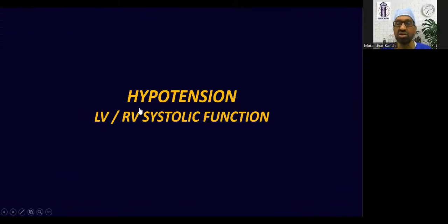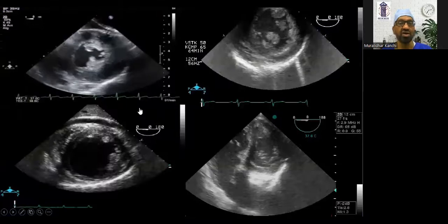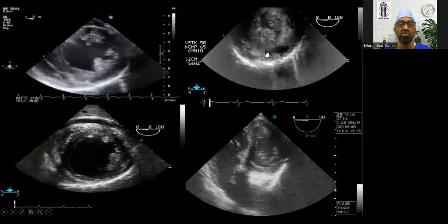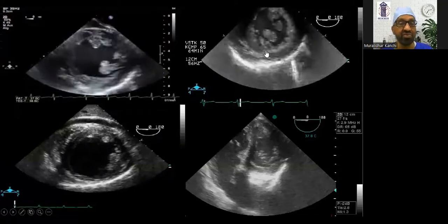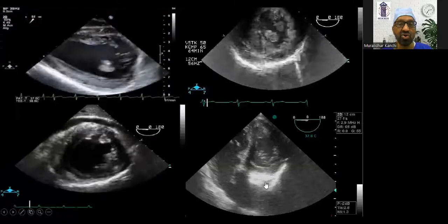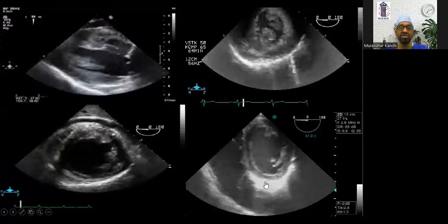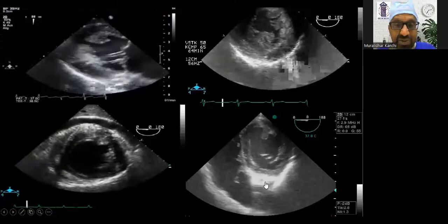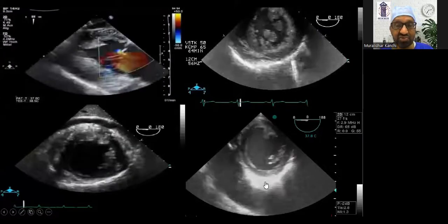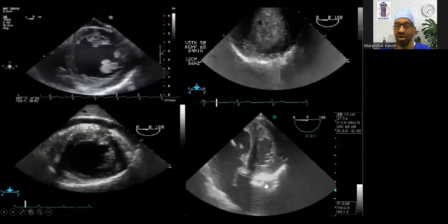Is it cardiogenic shock, or is the cardiac function normal and the patient hypovolemic, as shown in the right upper quadrant of the slide? Or is left ventricular contractility poor, or is there right ventricular dysfunction leading to septal shift to the left during systole as a result of acute increase in pulmonary artery pressure?